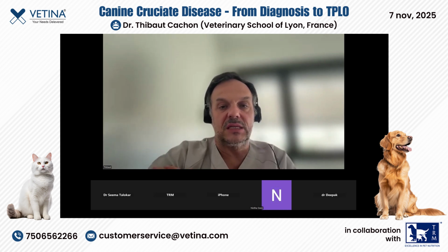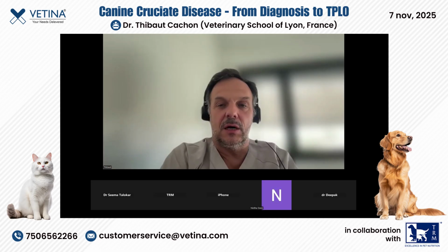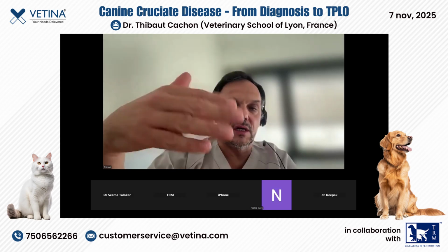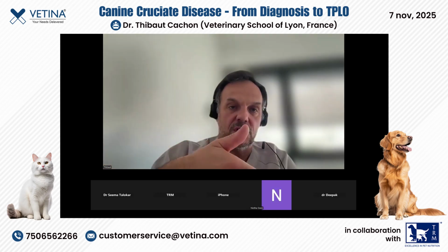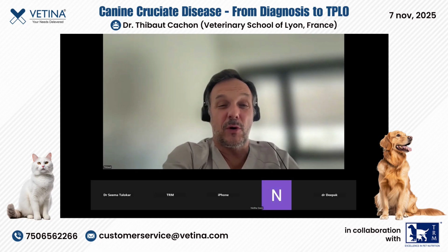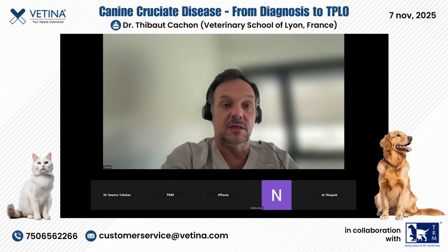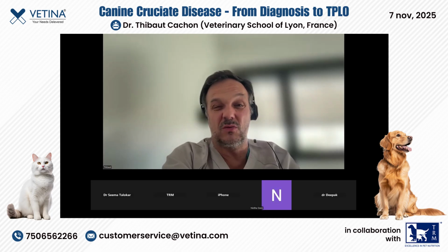I think that the next step for the TPLO is to combine extracapsular suture plus TPLO to get a full stability in full range, in cranial instability but also rotational instability. And perhaps also, in the next couple of years, we are going to combine intracapsular repair done under arthroscopy with the TPLO, which is quite difficult because of the screws everywhere.